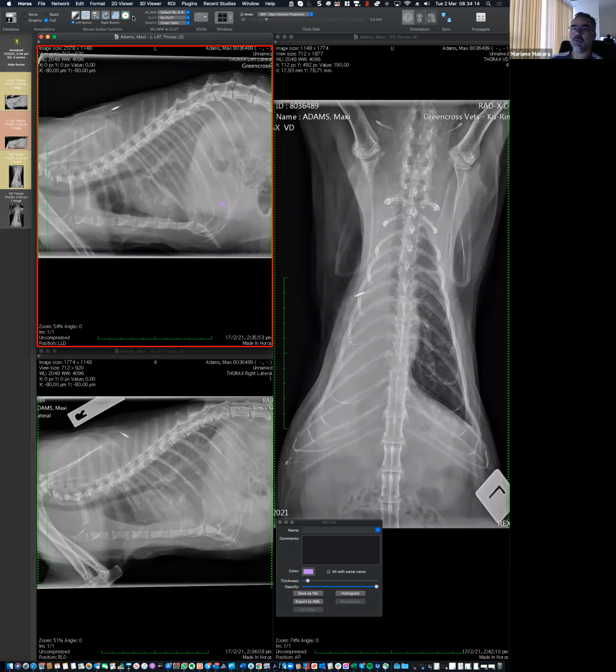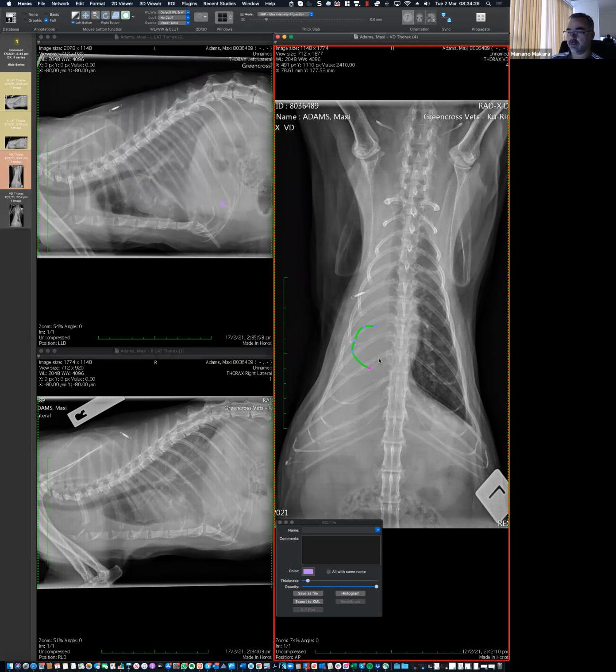So the classic mass would look like, I'm going to draw now. The classic mass should look something like this. Okay, so that's the textbook mass. And it's usually soft tissue, and it's usually surrounded by aerated lung. And that's why we see the borders. Makes sense? So that's like this nodule, or that nodule. So that's the classic situation.